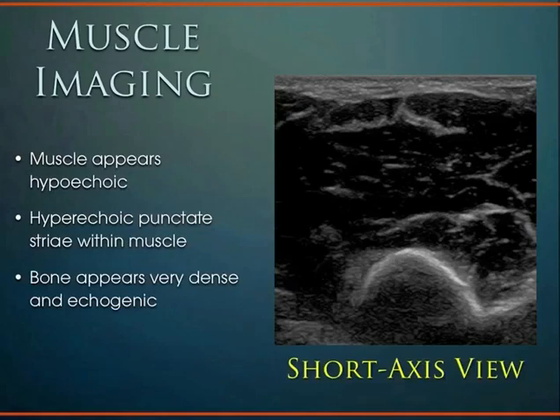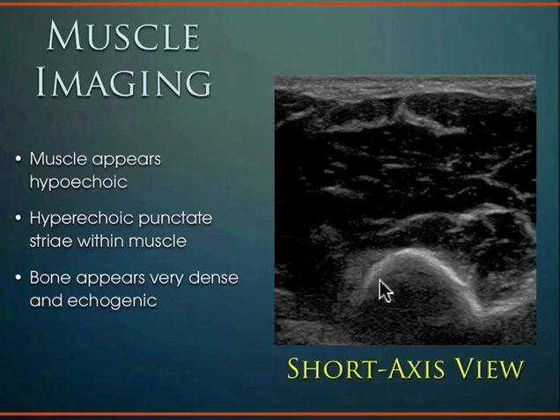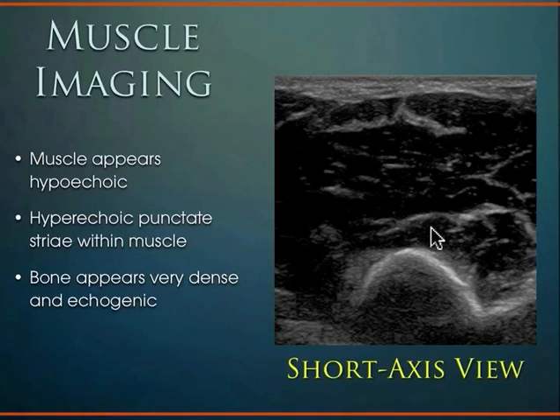That was the longitudinal view. In short axis — transverse or axial — view, you see more hypoechoic muscle structure with the deep bony structure below. The connective tissue dots in short axis view are referred to as the 'starry night' pattern — that interwoven connective tissue appearing as bright dots.